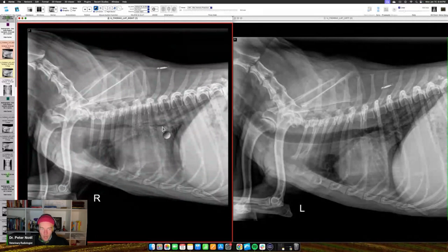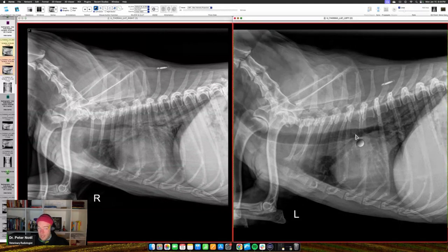So this dynamic change is the result of the following sequence of events, okay? The principal bronchi, the carina, totally gone, right? That is where the right cranial lobar bronchus pops off. So this area is the carina and the principal bronchi. People call them the mainstem bronchi. This area right here should be nice and gas-filled. Look at it here, it's just a mess. You can't see it because it's collapsed, and it's collapsed dynamically, as Amelia said.